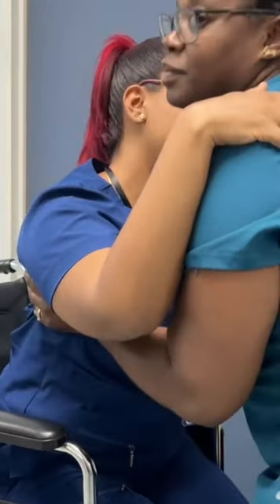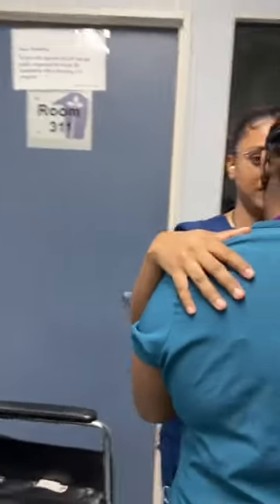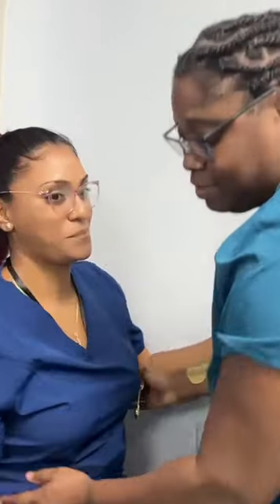Body mechanics being applied. She would communicate with the client and ask her if she feels any dizziness. You okay? Feeling dizzy? Great. Smooth transition.